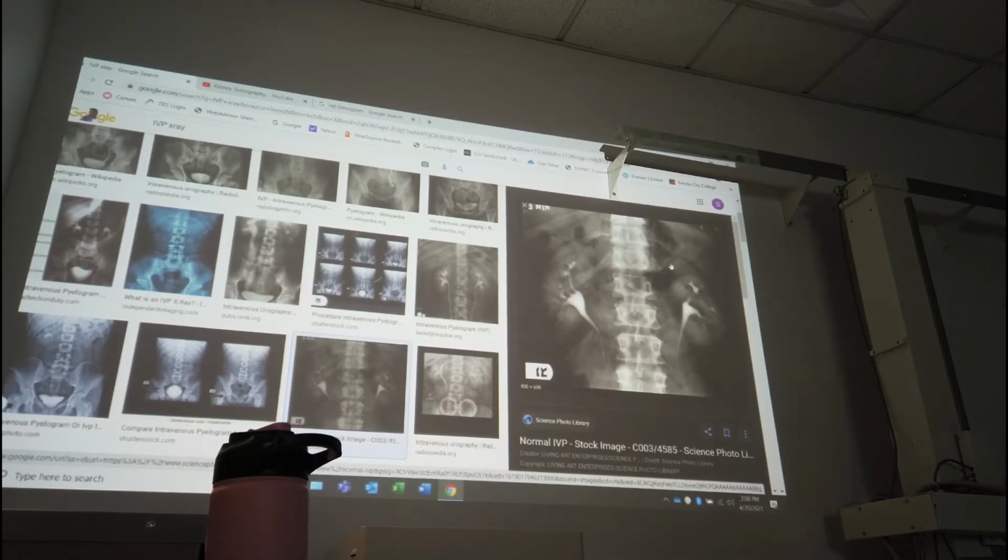And what that entails is putting a catheter, a urinary catheter, through the urethra into the bladder. Those catheters have little balloons at the end, so you pump up the little balloon with the little syringe so it doesn't fall out or anything like that. And then they'll pump the bladder full of contrast. And it's a good study. It's actually called a cystogram.